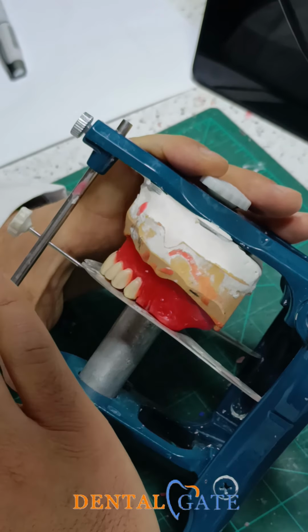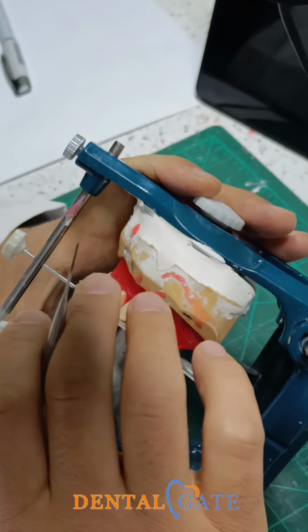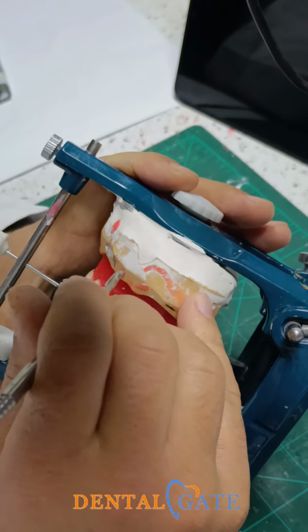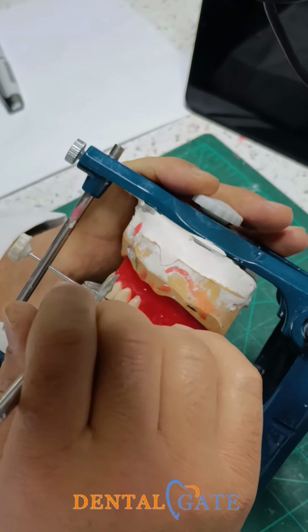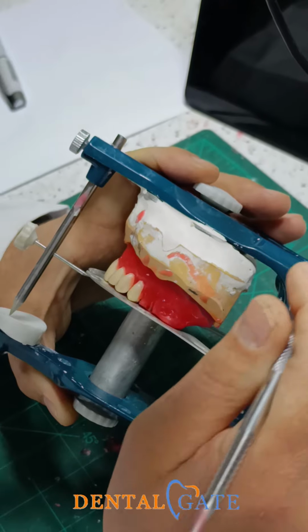Don't connect them with the anterior teeth. The anterior teeth should be performed individually. When you start with the posterior teeth, you already have a space to make a horizontal movement for the premolar, okay? To avoid troubles in the first practice.